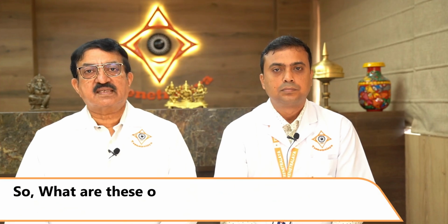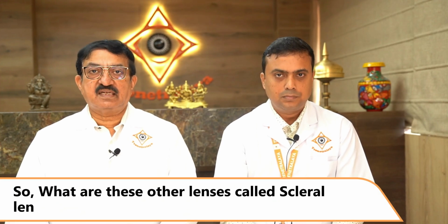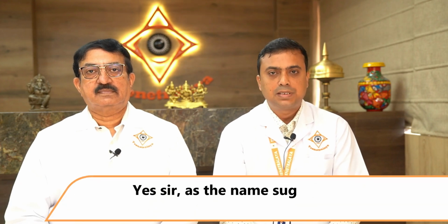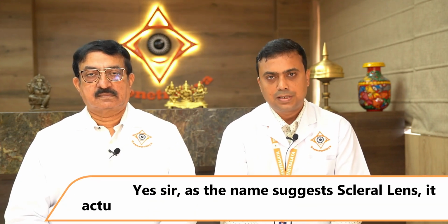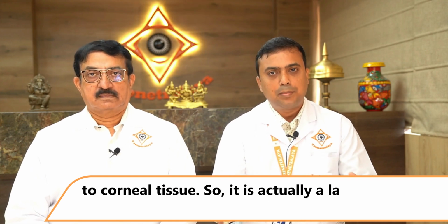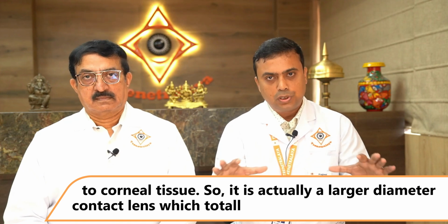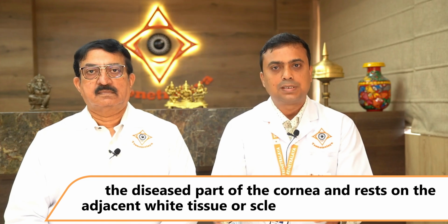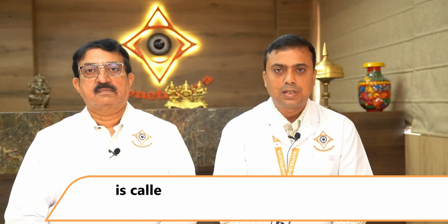So what are these other lenses called scleral lenses? Where do we use them? Yes, sir. As the name suggests, scleral lens actually rests on the scleral tissue, which is adjacent to corneal tissue. So it is actually a larger diameter contact lens which totally vaults the cornea or covers the diseased area of the cornea and rests on the adjacent white tissue or the scleral tissue. That is why it is called scleral contact lens.